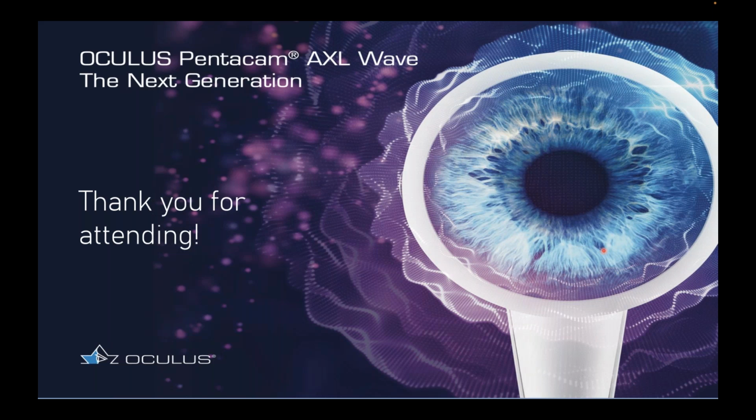What I thought was a good outcome 5 or 10 years ago, I probably would be a little bit embarrassed about today. And that brings up one more question I have for you. From my practice, I've been fitting RGPs for 35 years, and I have a lot of keratoconic corneal GP patients that have been wearing my initial designs that were like 9.0 diameters.